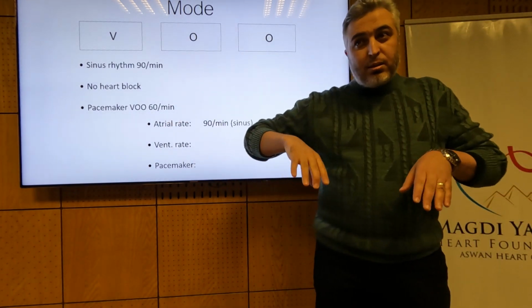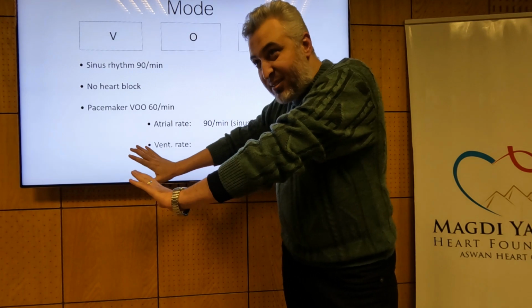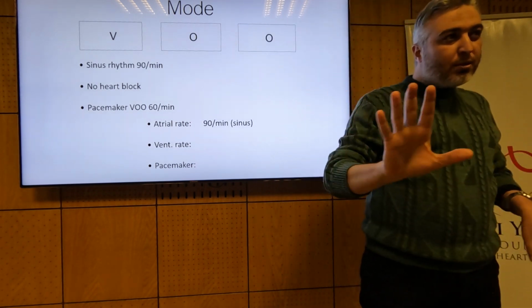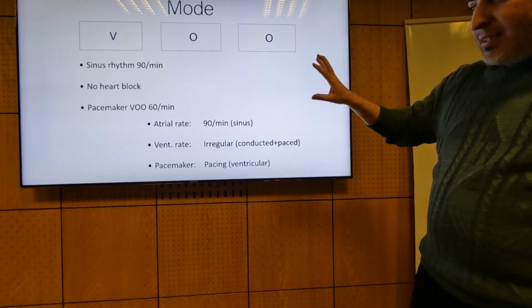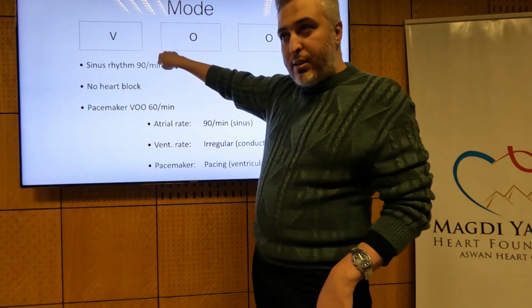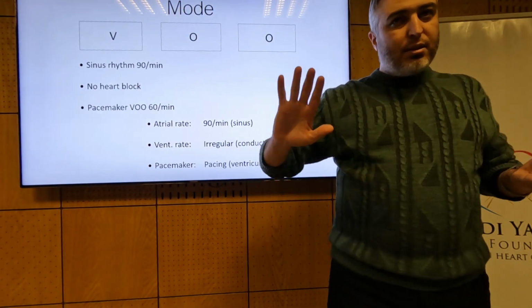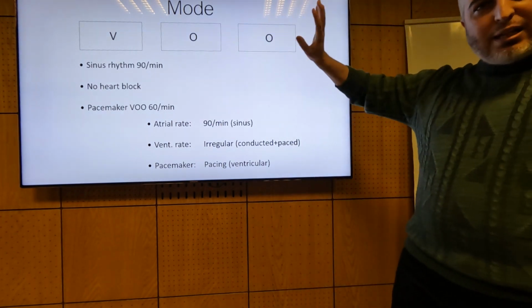When the patient had heart block and we paced atrial, we were not able to save him, but he was dying himself. Now we've actually killed him. You should absolutely not pace VOO. This is a dangerous mode that causes your patient to die. You're very likely to get R on T if the patient's own rate is faster than the pacemaker. You get the phenomenon of R on T, which ends up in VF. You should absolutely not do this. We're not containing any scenarios in this mode. This mode should absolutely not be used.